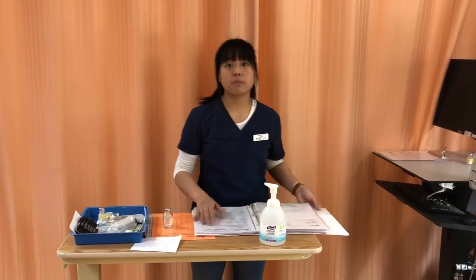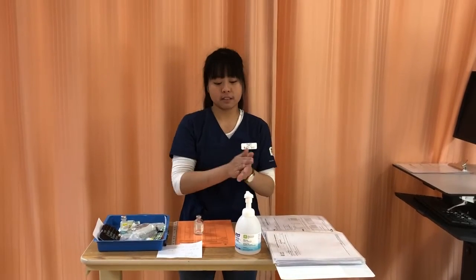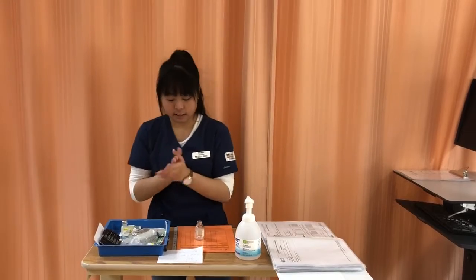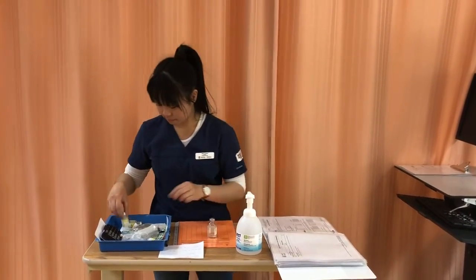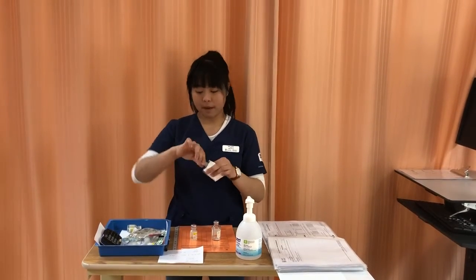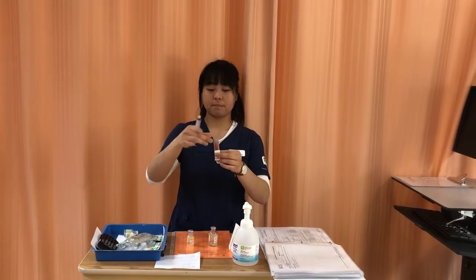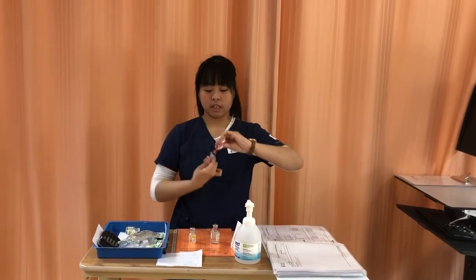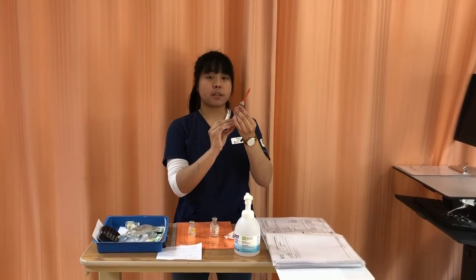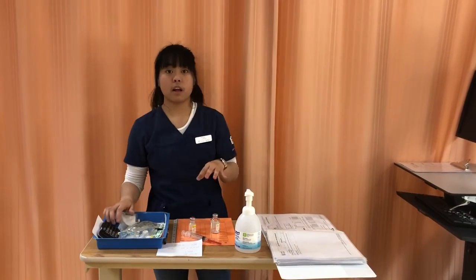So now I will just do my reconstitution right here. So first, I'm just gonna wash my hands. So primary line is running, and then I will be taking my vial here, as well as my normal saline, and my 10 mL syringe. Just gonna wing it back like so, and I will be getting my blunt fill needle. Just gonna do that in there. So I'm just gonna take out some air because it's new, and I'm just gonna put it aside. Make sure it's not contaminated as the tip or the cap is still on.